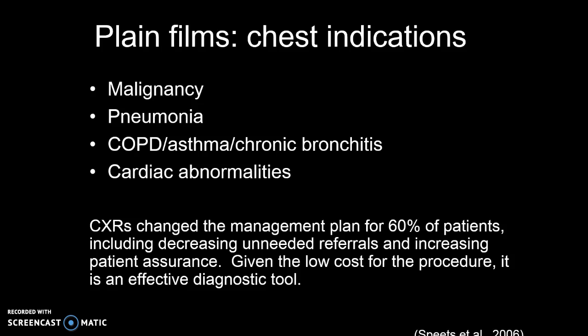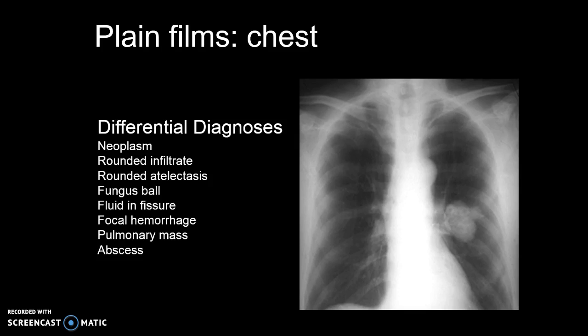A research article indicated that chest x-rays successfully changed the plan of care in 60% of patients, decreasing unneeded referrals and increasing patient assurance. Chest x-rays are a great, simple diagnostic tool for a quick look at malignancies, pneumonia, COPD, or CHF. Look at the image at the opacity abnormalities. Common differentials are included.